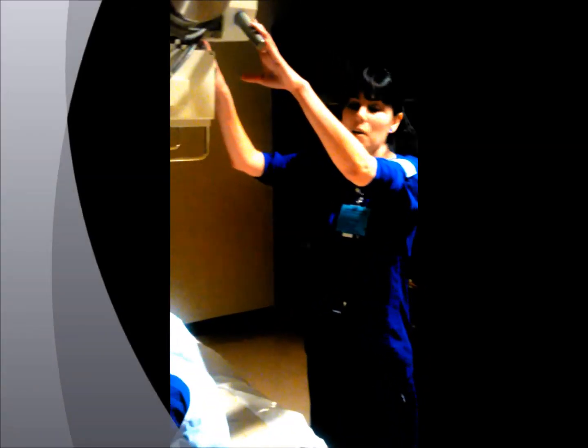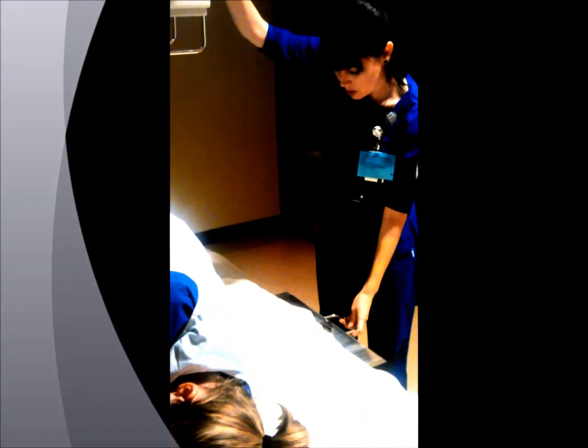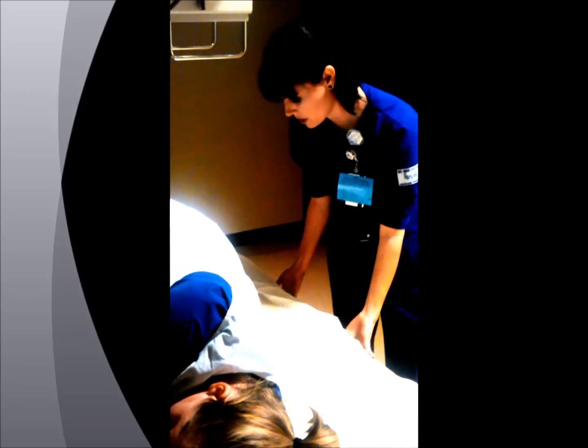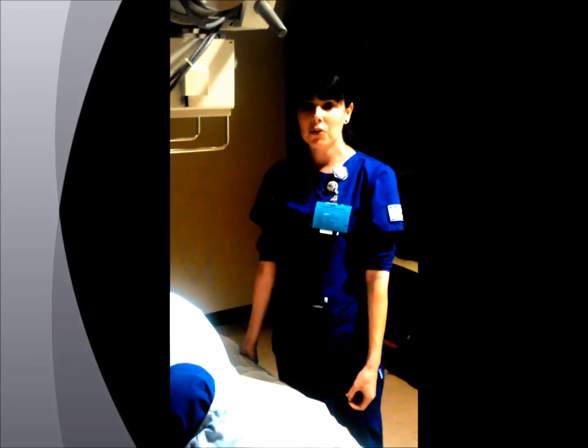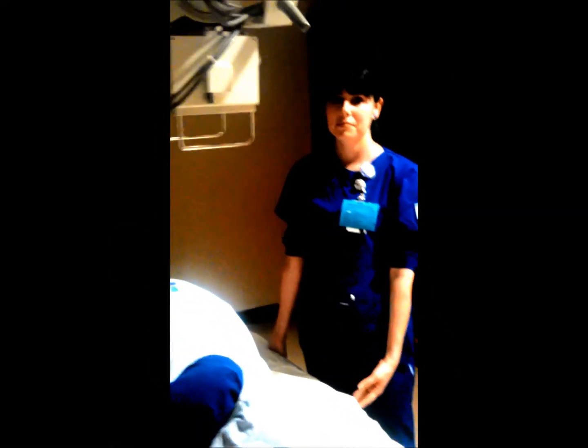All right, since I angled my tube, we want to make sure again that we're just aligned with the bucky. So if we have to, we can scoot it over since we did use an angle. If you're not using digital equipment, you want to make sure that it's aligned. Then I'll set my technical factors at 90 to 100 kV, and then I will expose on expiration.